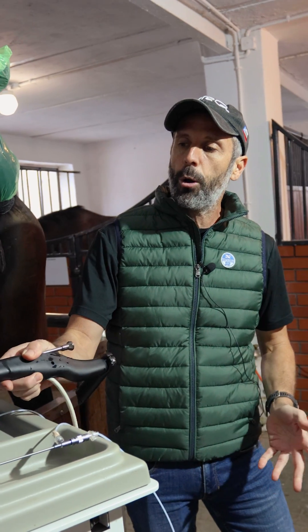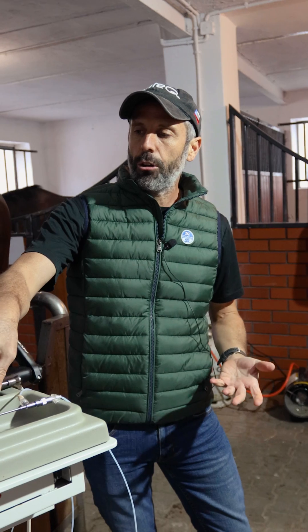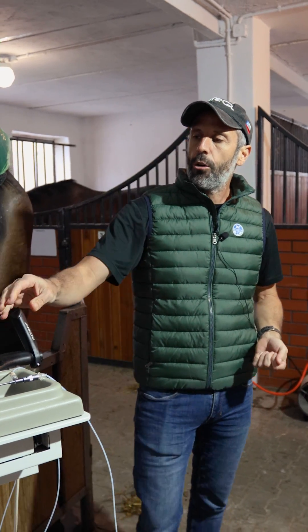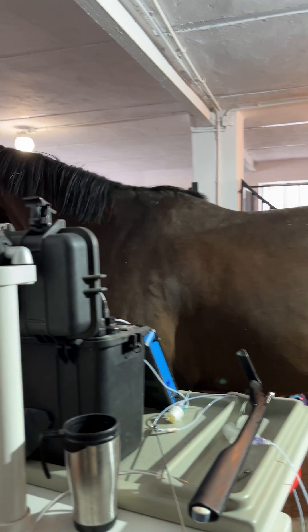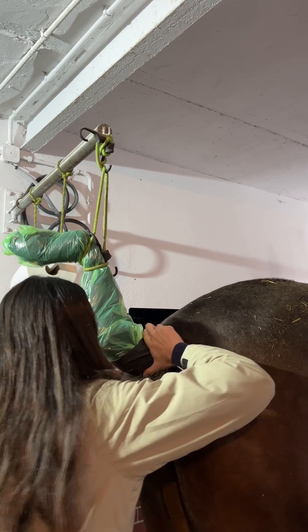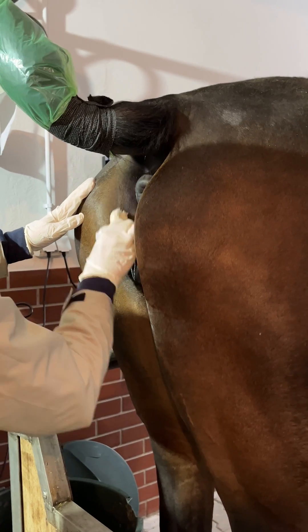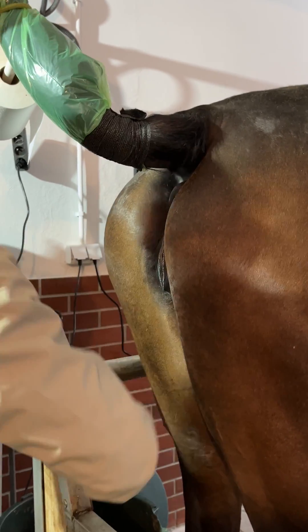Also in Spain, I use the monoblock. Even though it's designed for heifers, I like it a lot for mares because it's a very compact probe. It's sealed so the blood doesn't go inside like in the others in the market. But the monoblock is very light and it works really good.